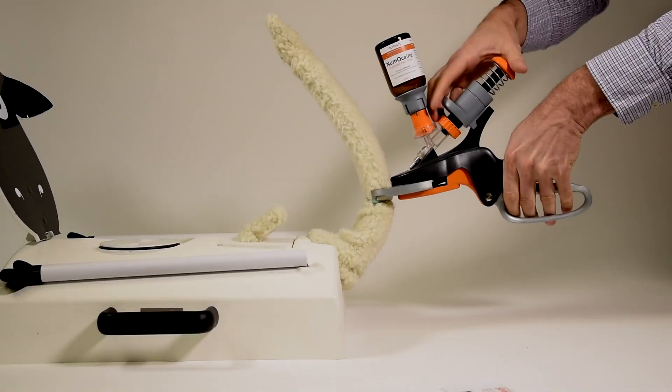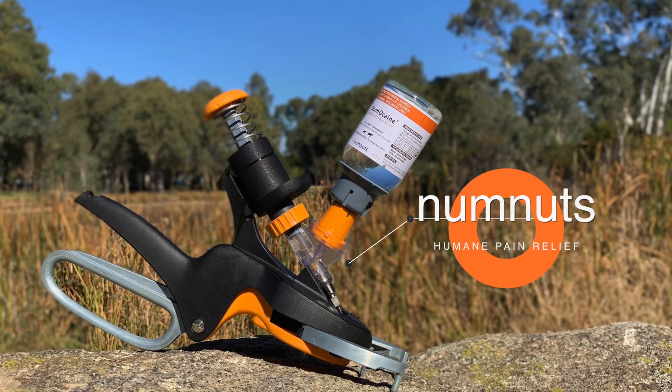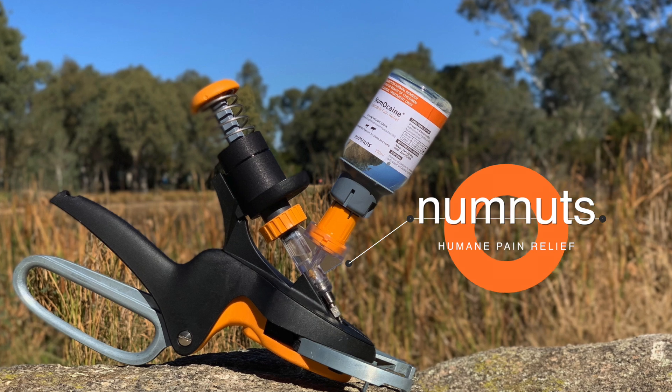We spent years designing, testing, and refining a system that's fast, safe, and simple to use — and here it is: the patented Num Nuts device.